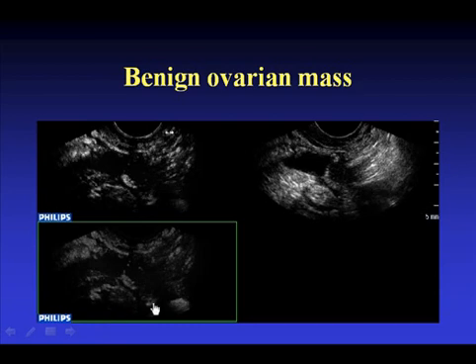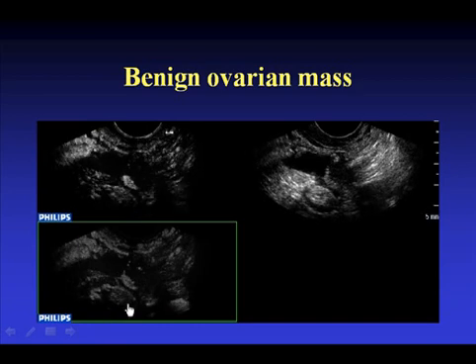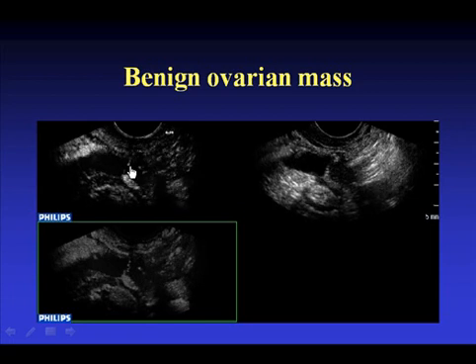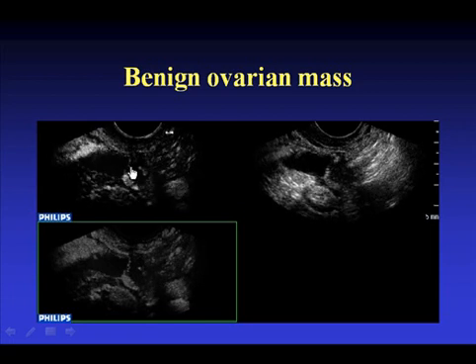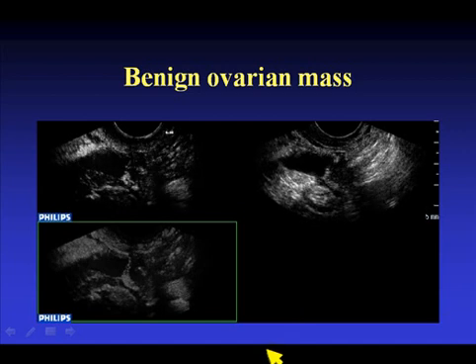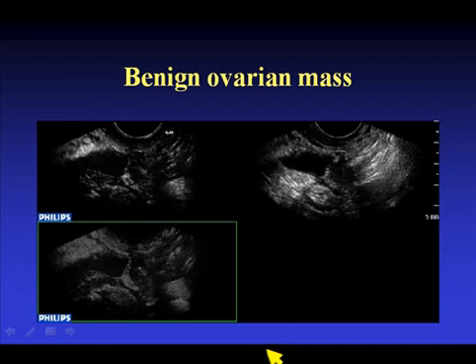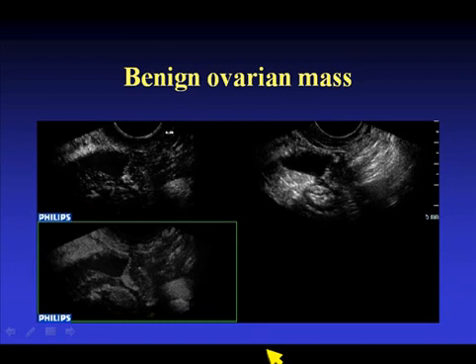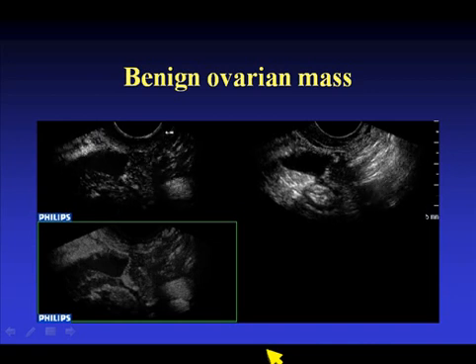This is the microvascular, which is the persistence image. And one could see that there was no increased vascularity in the wall of this morphologically suspect benign lesion. And we can quantitate the blood flow that we see with contrast using the following parameters.